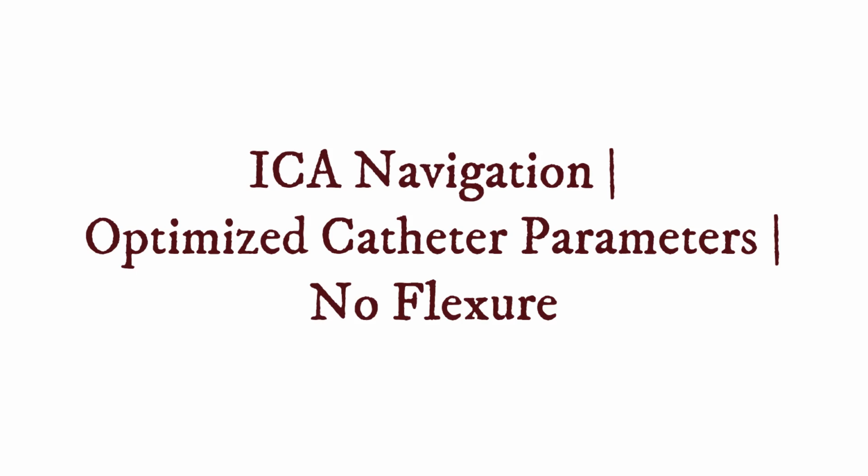The geometric parameters of the catheter affect its ability to follow the desired vasculature. To solve for the optimal catheter parameters, we use a design score that penalizes both the average and the maximal path following errors along the ICA.